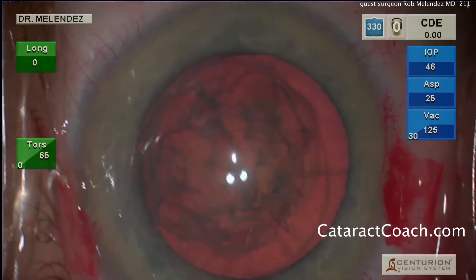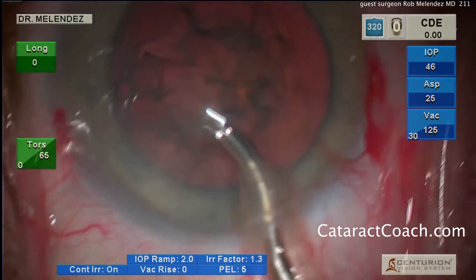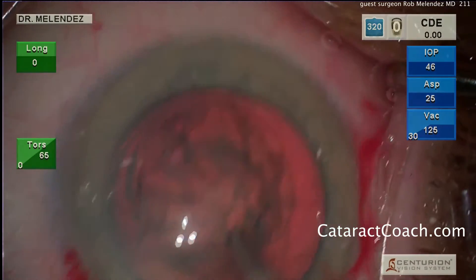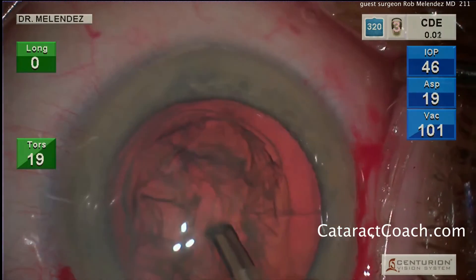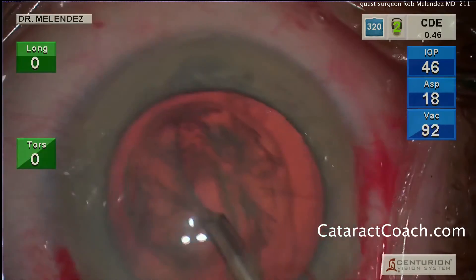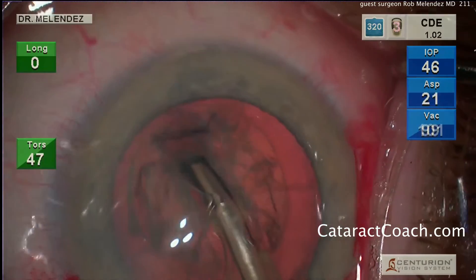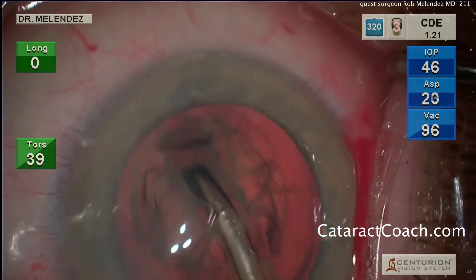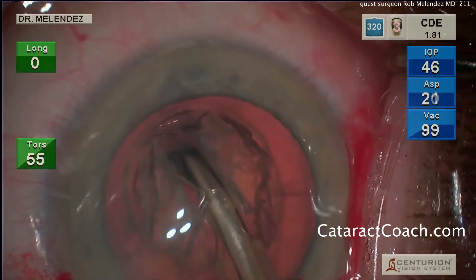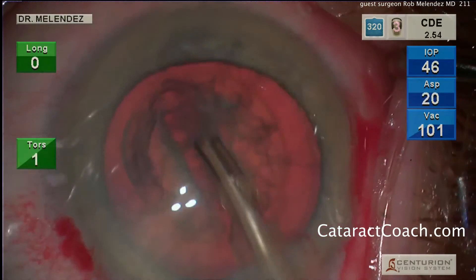Now let's look at the settings. It looks like 65% on torsional power — that's the green numbers on the left side of the screen — zero on the longitudinal. A low or normal IOP of 46. Aspiration and vacuum are relatively low. This is a pretty typical setting to make the grooves, which he's doing now — grooving a central trench in the lens nucleus with appropriate depth, also going sub-incisional to ensure the full length of the groove is complete.